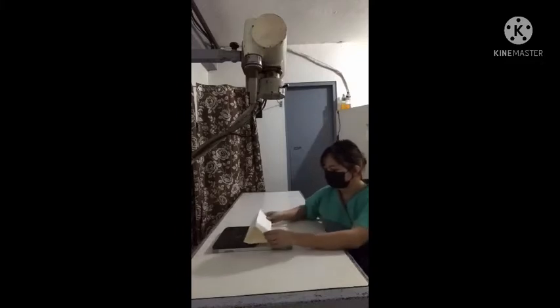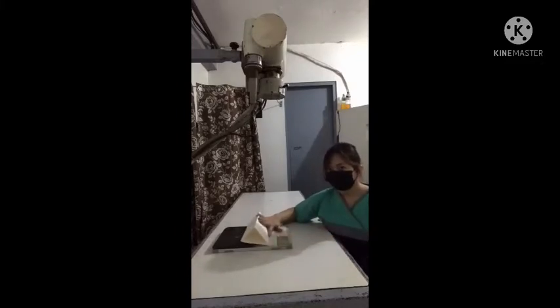I don't have a sponge wedge here, that's why I used a 45-degree cardboard to show you how the sponge wedge should be used on this projection.